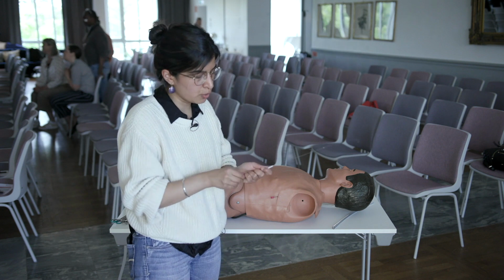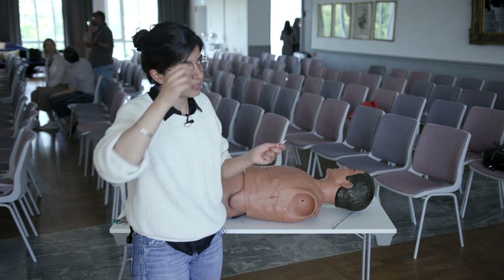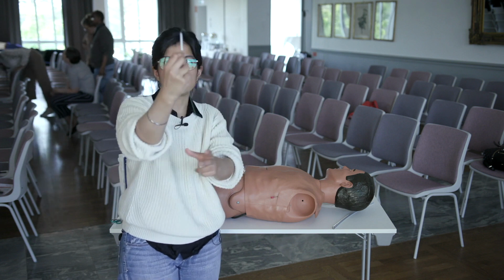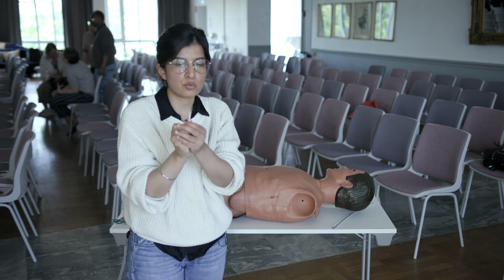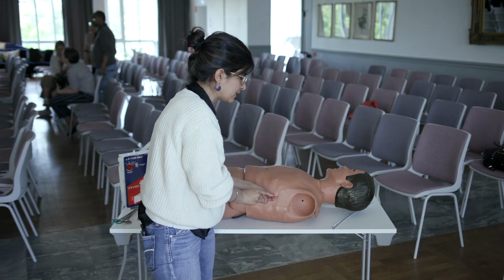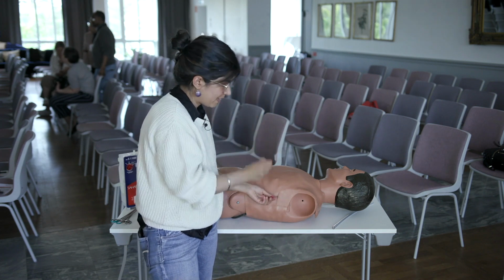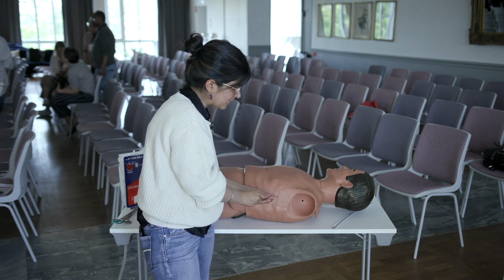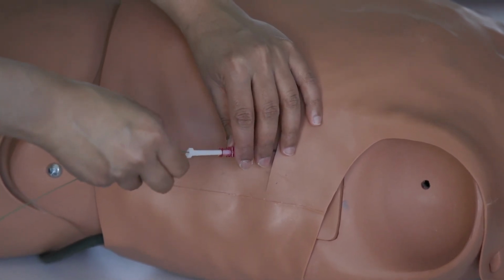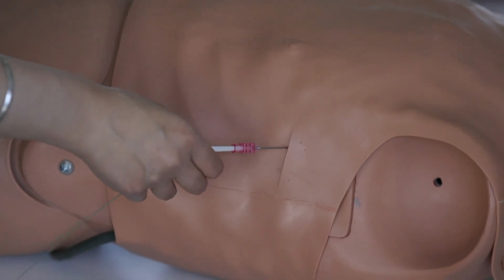But just a quick little note, and this applies to any time that you have to use a Seldinger technique: A-lines, central lines, pigtails, whatever you're doing. It always comes like this in the kit, a J-loop. So you push this, but some people will push it all the way, and then they have a hard time engaging the needle. So you want to have just a little bit of the tip sticking out, and that's going to be straight enough, but you can engage the entry point on the inside of the needle. Sometimes it gets really frustrating because you're trying to pass the wire and it's not passing. It's because the tip's not engaging, okay?